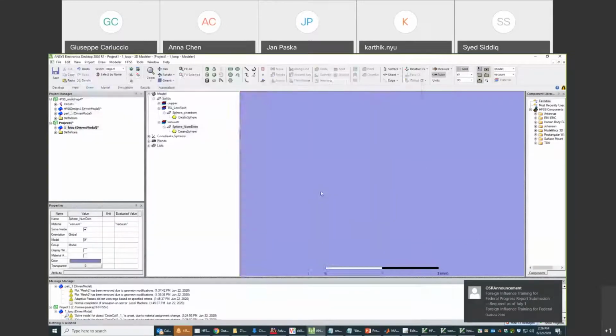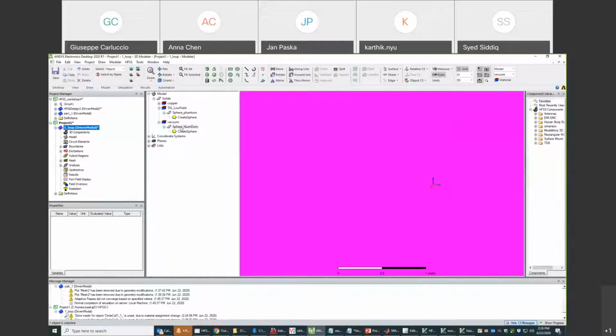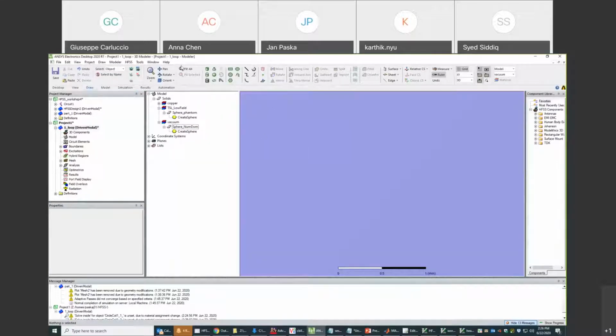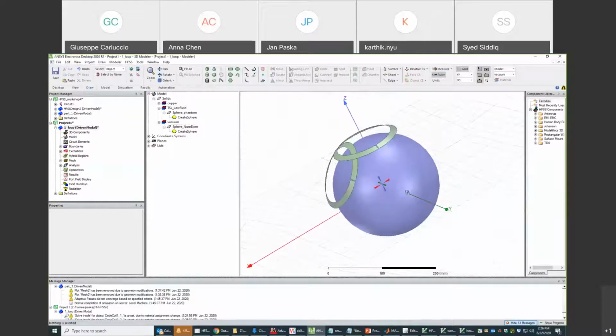And that way you can create very variable models. Let's have a look. I think it's finished now. So this is the model that we just created. Let's hide this numerical domain sphere. And this is the model that we just created.